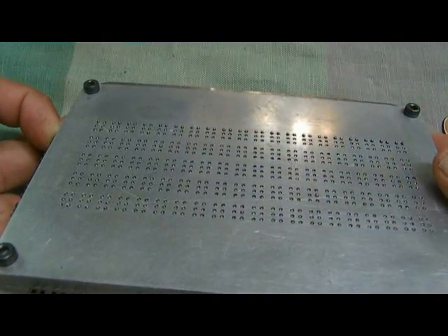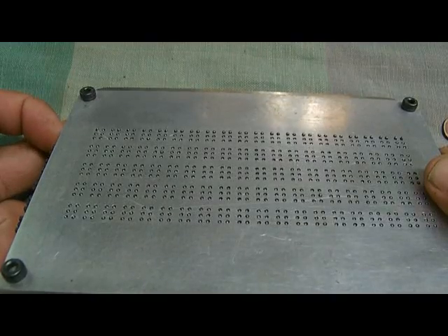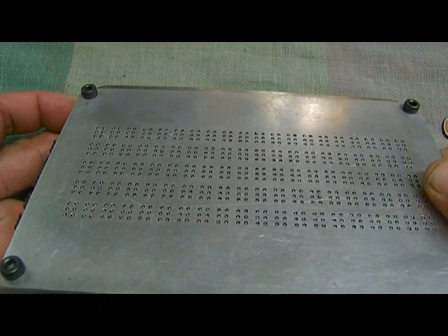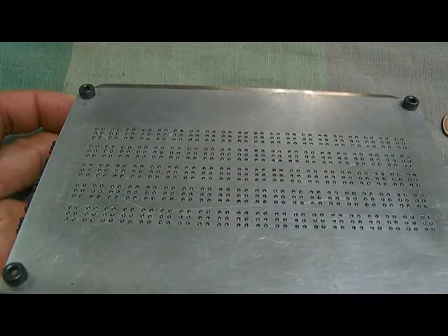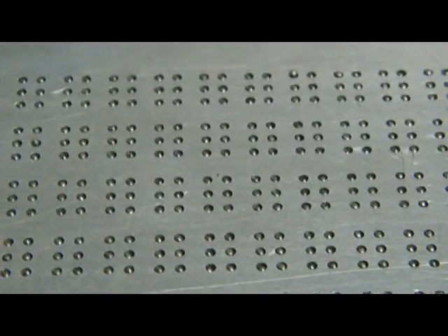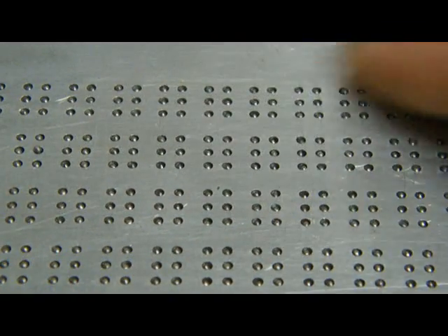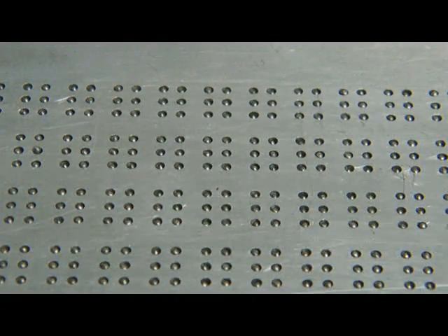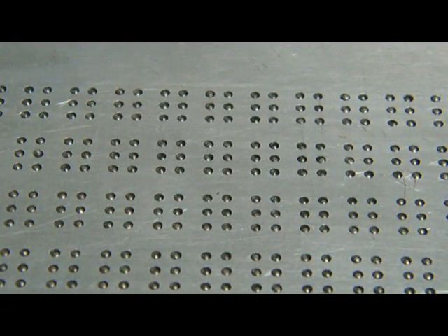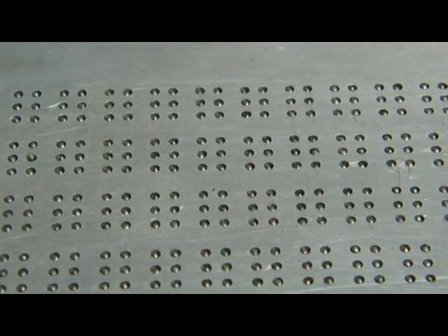Now I'm going to actually zoom in so that you can get to see the pins, a real close-up of the pins jumping up and down. So as I zoom in, I need to give it some time to refocus. Okay, I think we can see that's the top row of pins. They fall by gravity, but since I've tilted the display, the gravity is not doing a very good job. So okay, now all the pins are down.